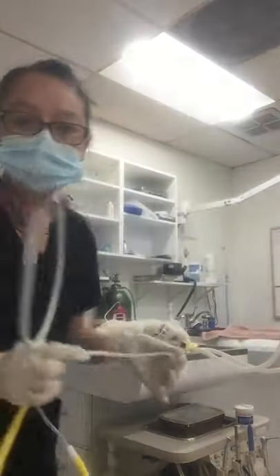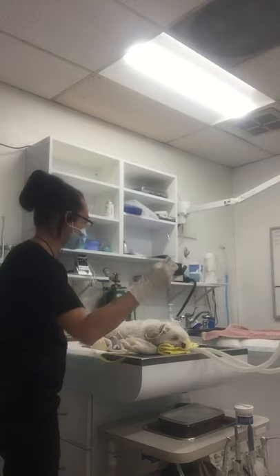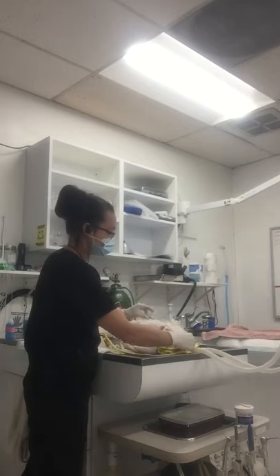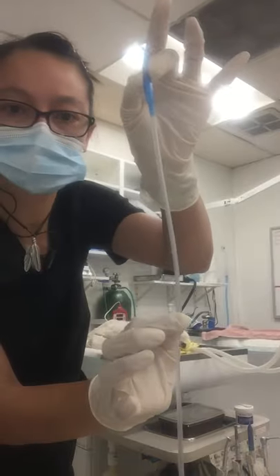First we're going to measure. The distal end of the esophageal stethoscope is going to be measured from about the shoulder blades to the snout, and that's about as far as you want to go in. So that's as far as I'm going to go into the esophagus to make this measurement.